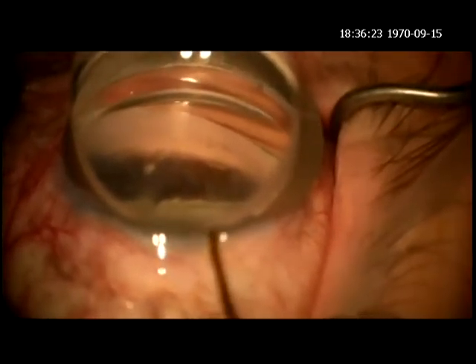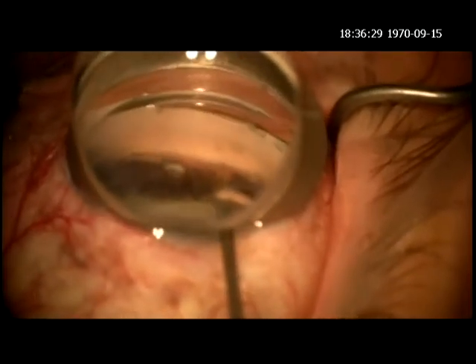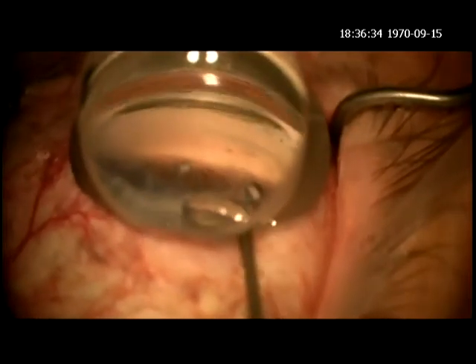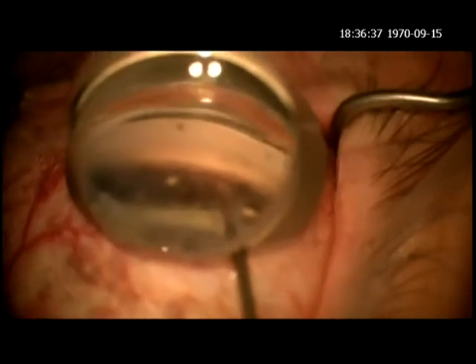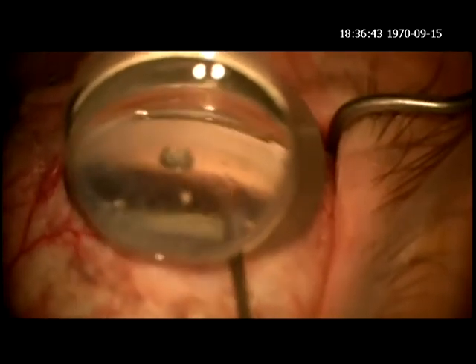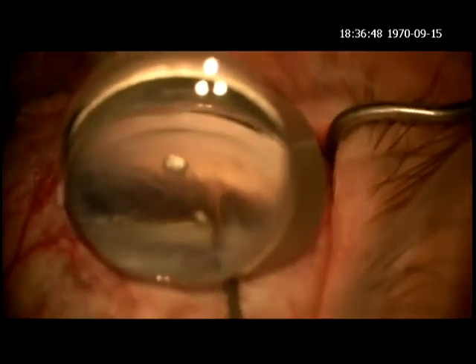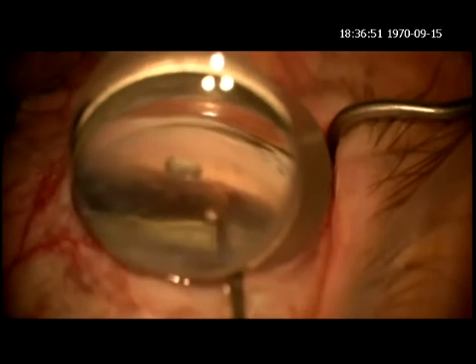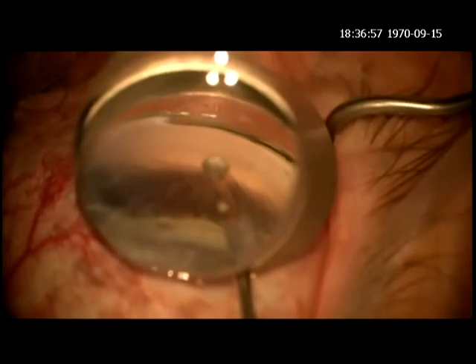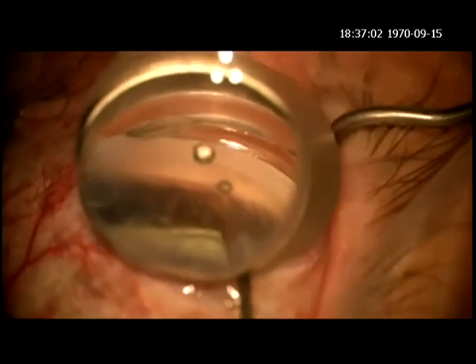In cases like this, with traumatic aniridia, the anterior tips of the ciliary processes tend to form synechia anteriorly, and so I'm using the anterior tip of the Cypass to attempt first to bluntly dissect posteriorly to obtain access to the supraciliary space. With this first attempt, I'm not able to obtain access to the supraciliary space, but I am able to dissect the synechia posteriorly so that we can then see what would be, in a normal eye, the ciliary body band.